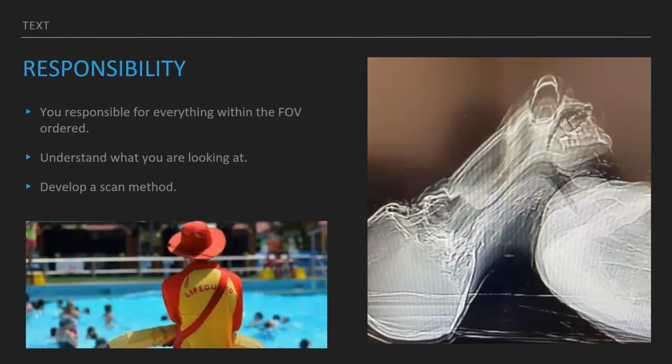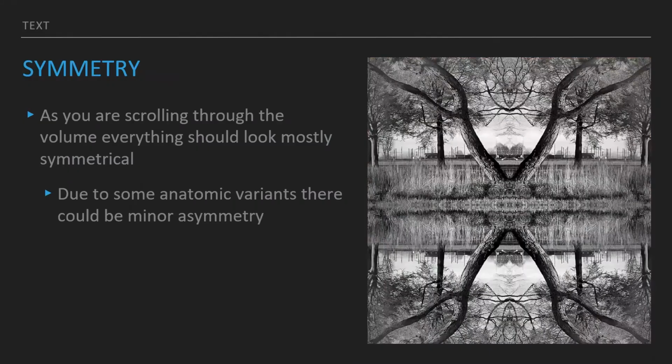If you don't know what you're looking at, phone a friend. There's nothing wrong with reaching out and getting some input from a radiologist. And this person over here decided to move during a CT scan.